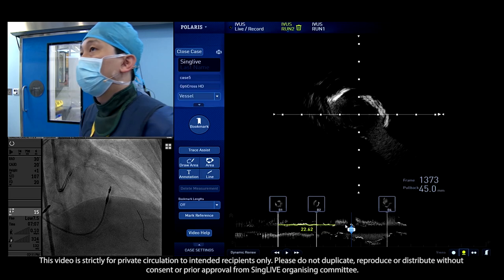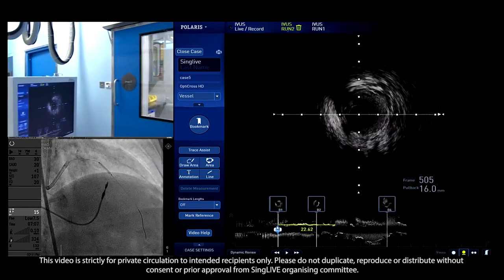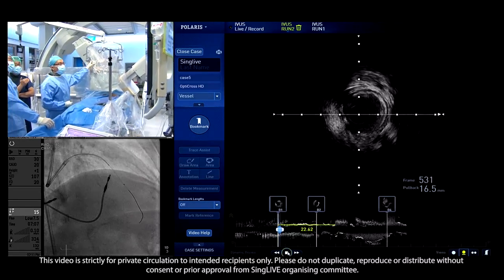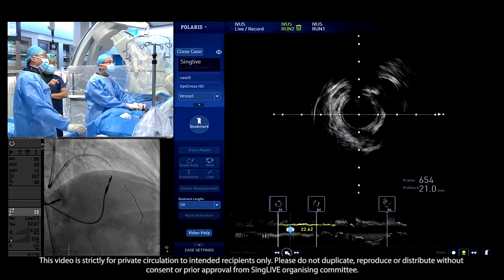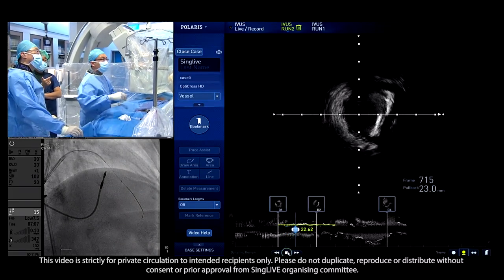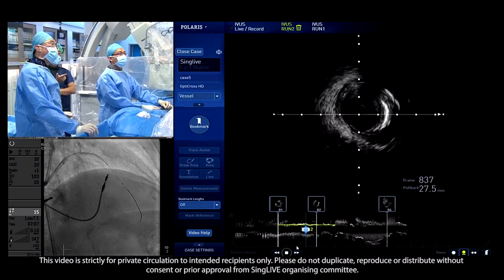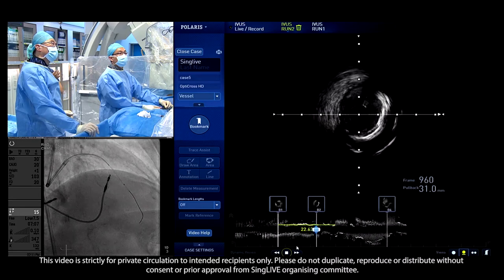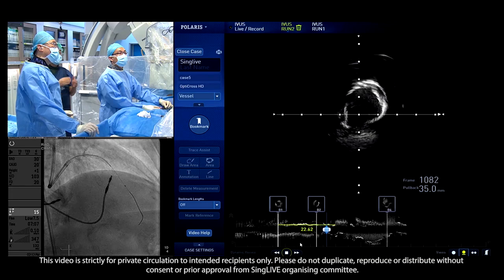Technically, if you decide on an upfront two-stent strategy, we have some discussion points. Looking at this region, with a very acute angle, nearly 90 degrees, which stent strategy do you prefer? Crush, TAP technique, or the Culotte technique? There is much debate about that. And the second debatable portion.